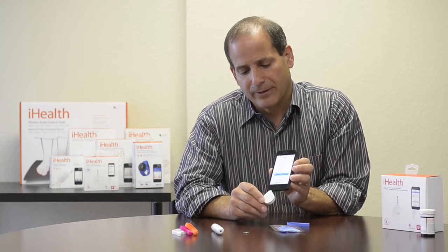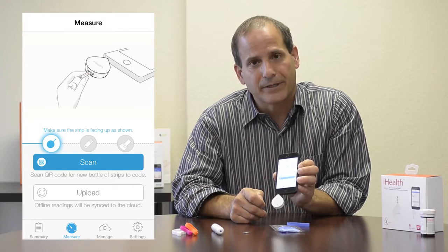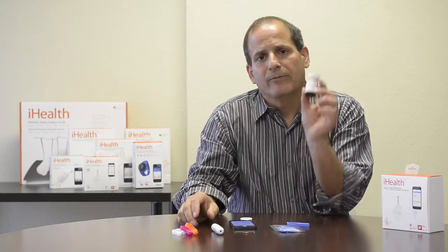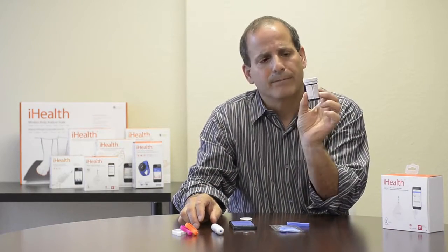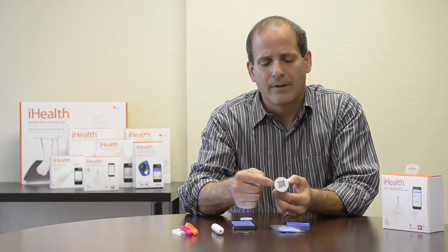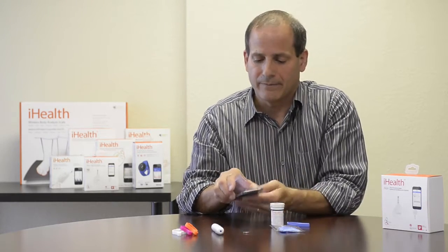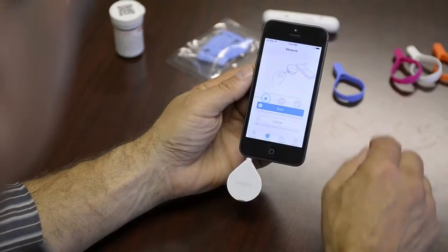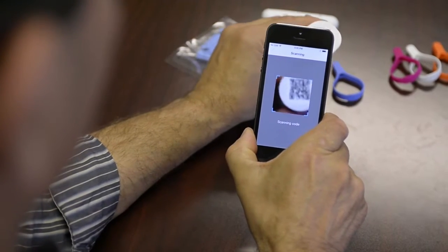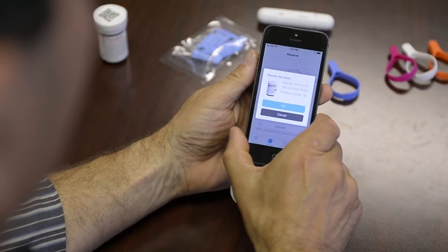I've inserted the device into the phone jack and said yes, and a little blue light on the left tells me it's ready to go. The next step is to insert a strip. Before inserting a strip for the first time from a new vial of iHealth test strips, I need to scan the bottle using the QR code at the top. On the app, I hit scan, which opens an automatic QR code reader, and I hold it over the bottle and let it scan.